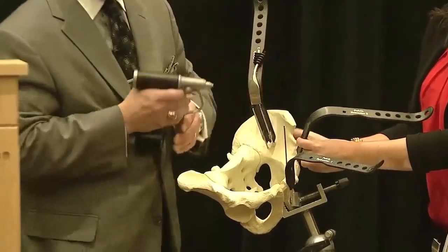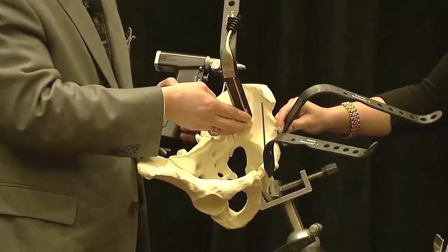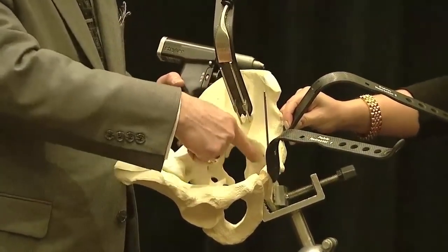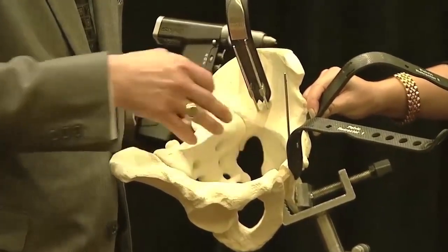So what happened here is we pulled the rectus out of the way, we've lifted up the rectus and the psoas muscle, and we pulled the vessels out of the way. Looking in this window from this view, you can see, as we dissect, the whole quadrilateral surface, the dome of the acetabulum, and the greater sciatic notch.